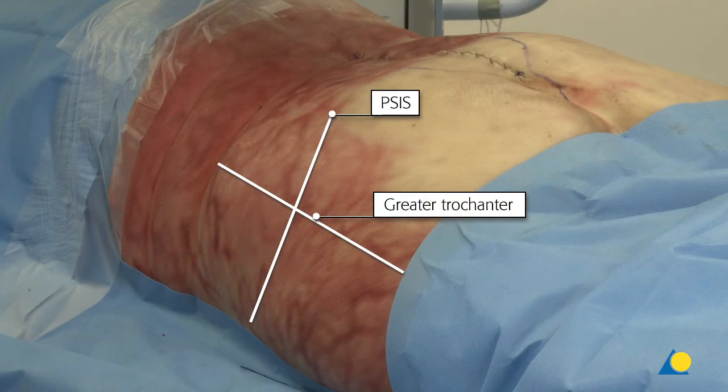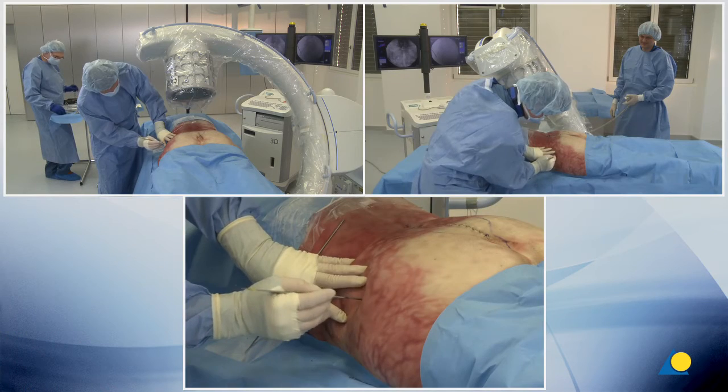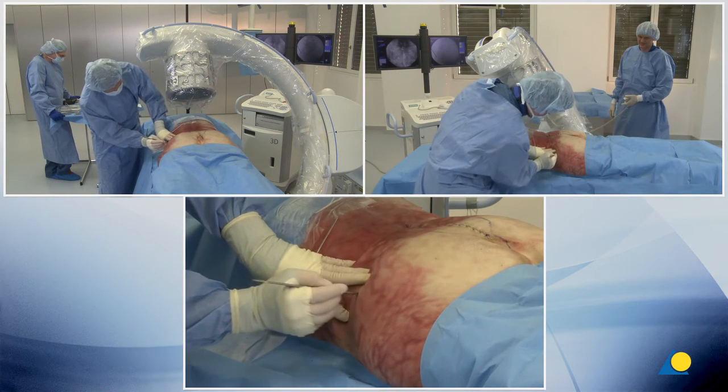A stab wound is made where a line from the greater trochanter to the iliac crest crosses with a line dropped perpendicular from the posterior superior iliac spine. The incision should be down to the bone of the iliac crest to avoid the soft tissues deflecting the guide wire.